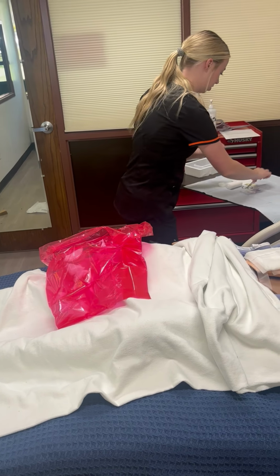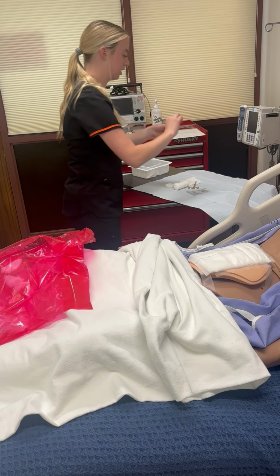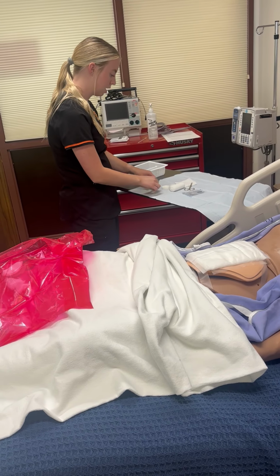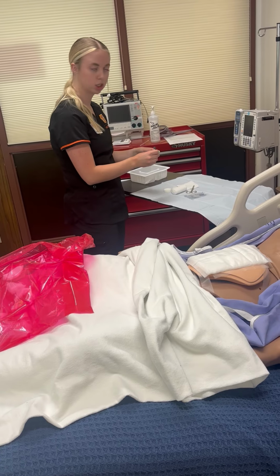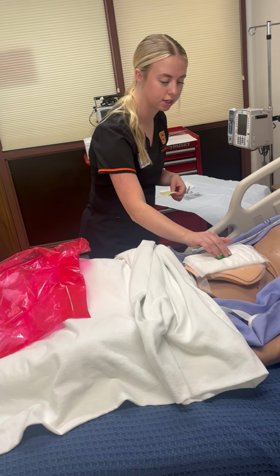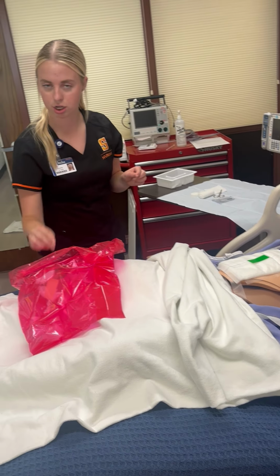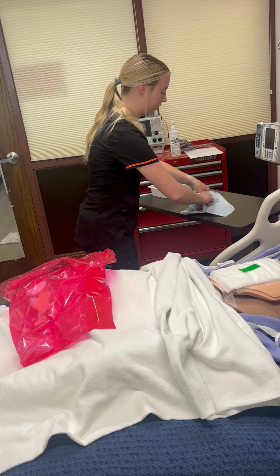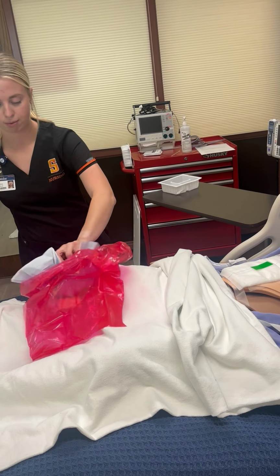I am going to place this. I'm gonna write on here the patient's name and their date of birth and the dressing change, all of that, and sign it. And then I'm going to stick it on to my patient, not touching anything else. And then I can now clean up my sterile field. That will go in my red thing.